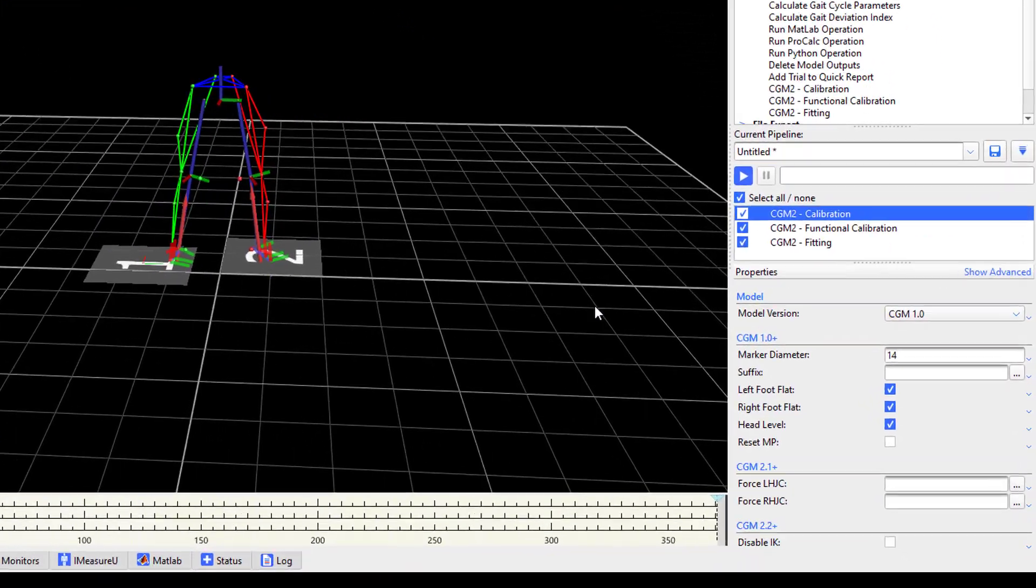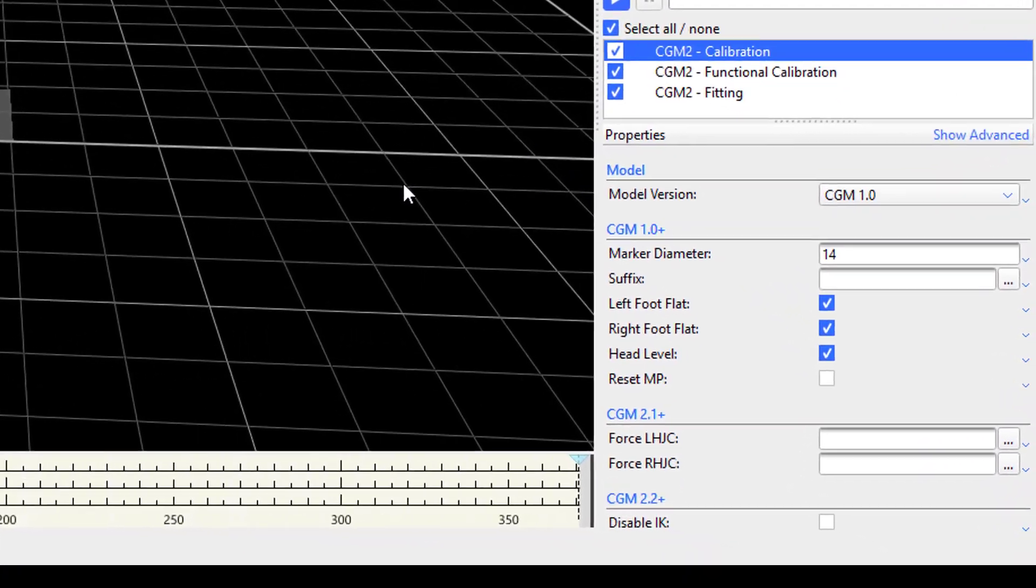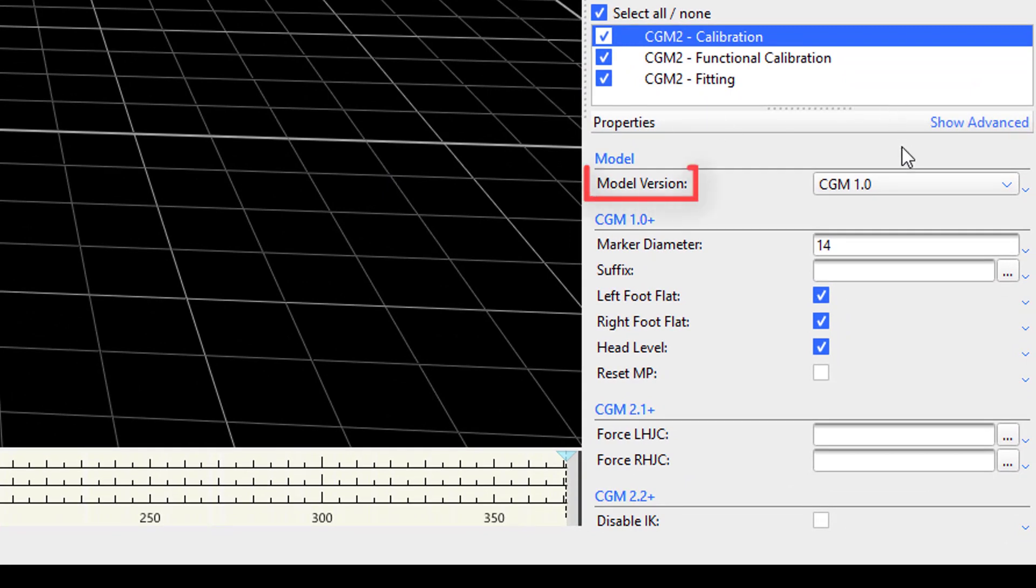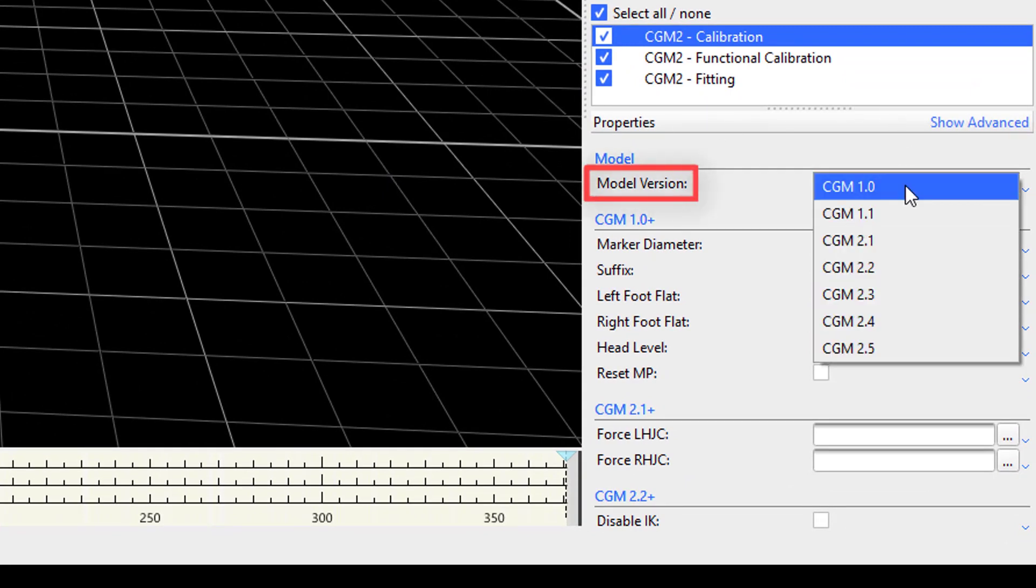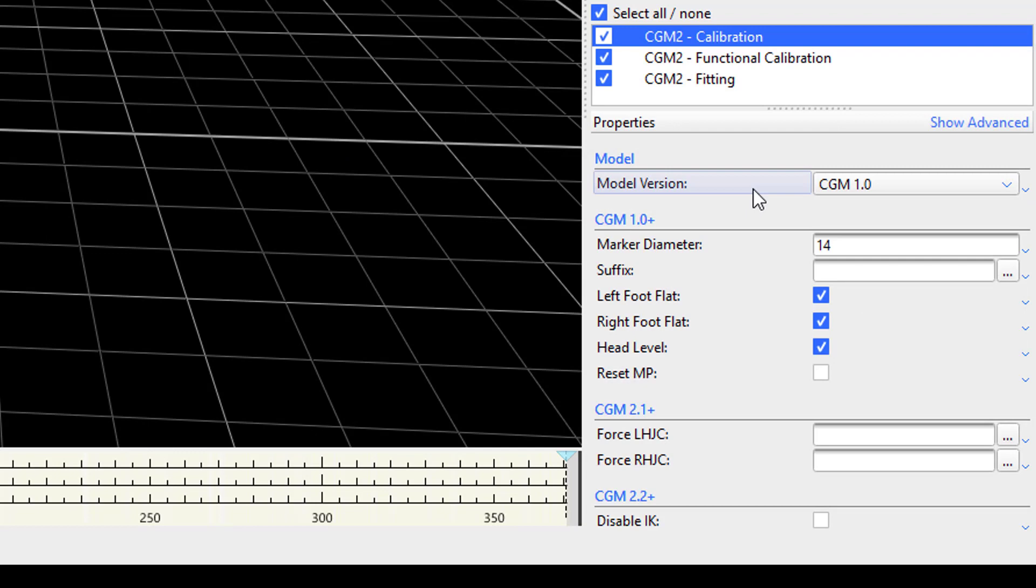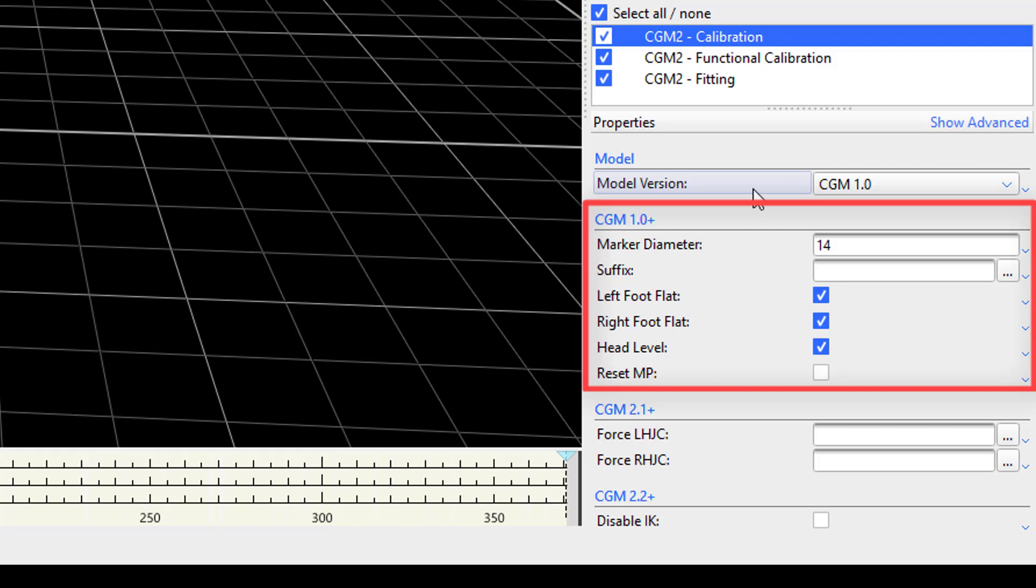In CGM2 calibration, there are four sections within its properties. The first section lets you specify which model you wish to use by using the dropdown menu next to model version. For those with experience processing using the plug-in gait model, the next section, 1.0 plus, will look familiar with properties such as marker diameter, and the ability to designate whether the feet or head are flat during the static trial. These are joined by a couple more parameters. The suffix field allows a user to append characters to the model outputs. This is especially useful if you are comparing the model outputs of multiple models which have the same output name.